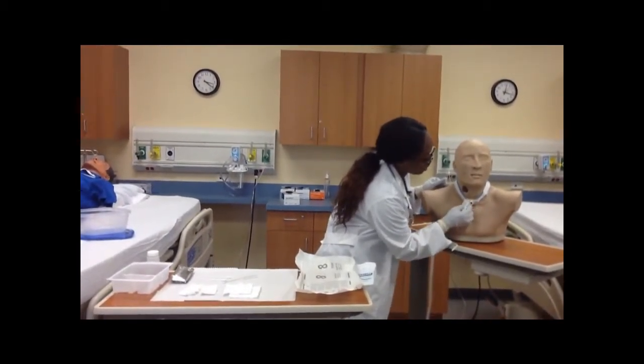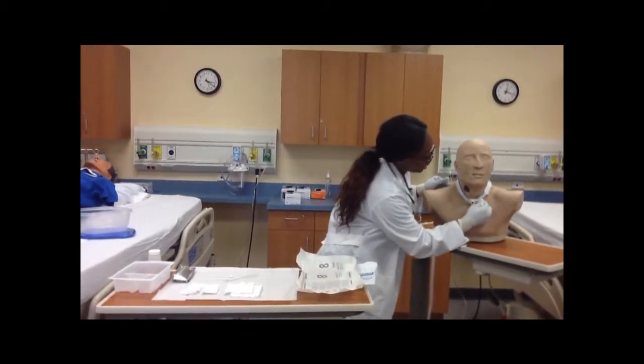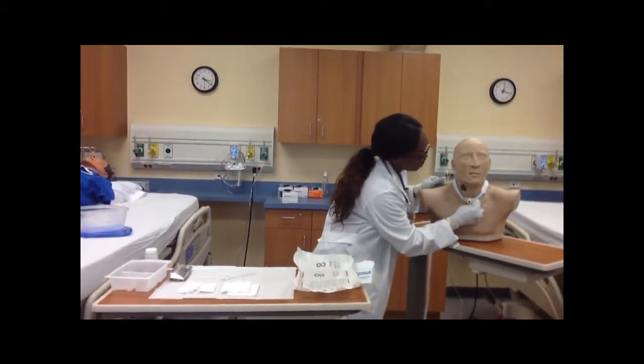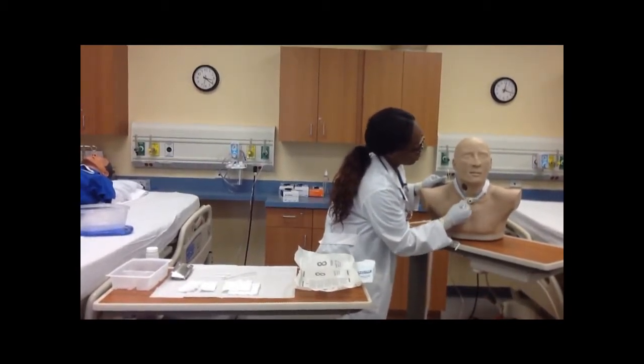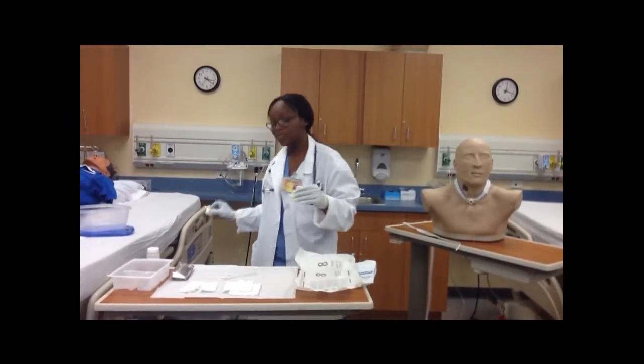I also clean around the patient's neck, just in case there is any gunk that accumulated around it. And I throw this away.